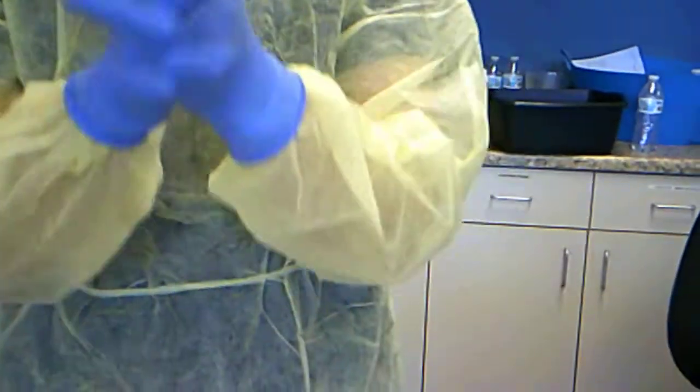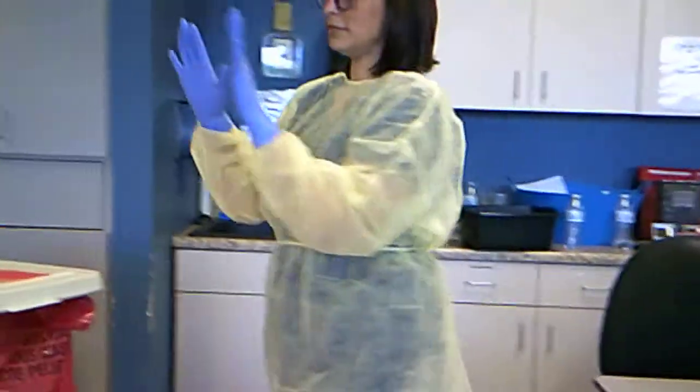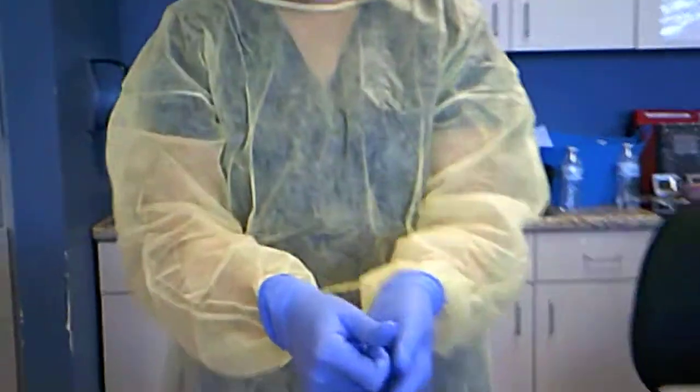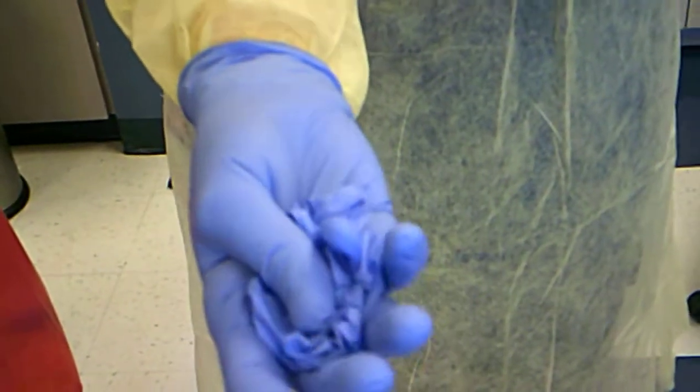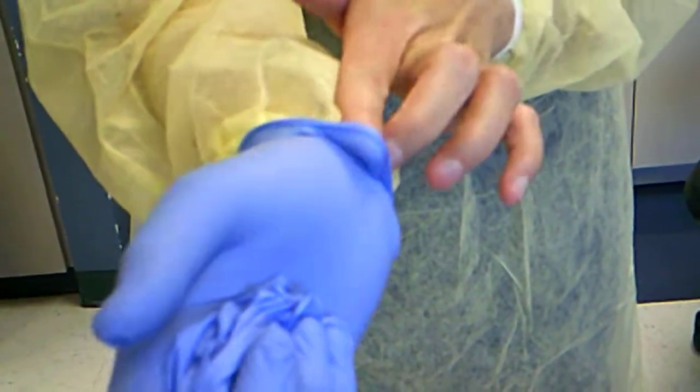Tuck that in. Show your fist and turn in a fistful. And now we can remove them. We're going to take our gloves off — grab from the palm of your hand and pull that down. Crunch that up in your hand, then go under your glove and slip that over, so you never touch the outside of your glove. And this always goes in the biohazard.